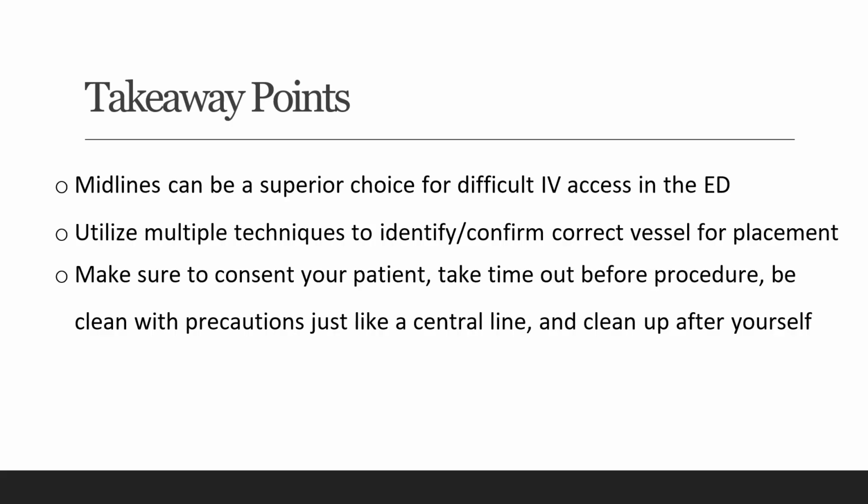And lastly, to be a good citizen of the ED, just make sure to consent your patient if it's necessary. Take your time out before your procedure. Be clean with all your precautions. Wash your hands. Put on your cap. Put on your mask. Go on your sterile gown. Get your sterile gloves. Use sterile drape. Make sure you have plenty of CHG sticks to be able to appropriately sterilize the skin of your patient and keep everything clean. And then once you're done with everything, just make sure to put your sharps in the appropriate receptacles, and then put the trash in the appropriate places and get the room nice and clean. Your patient will thank you and your nurses will love you.